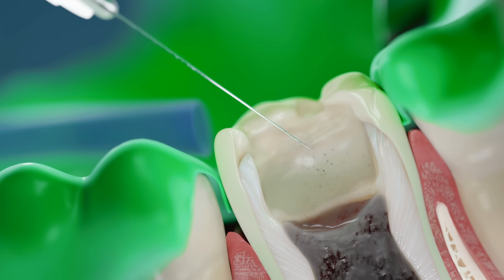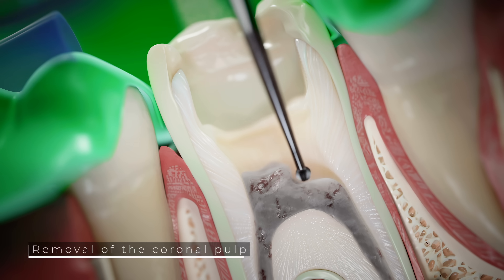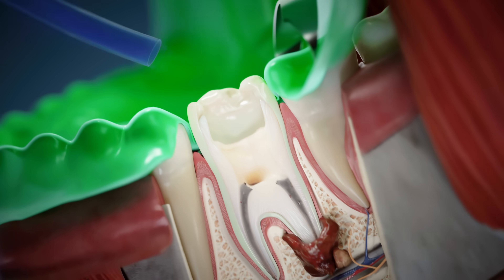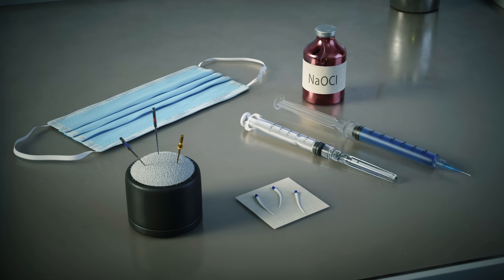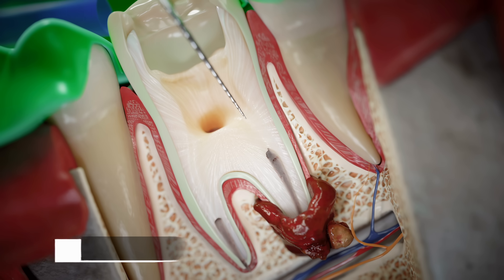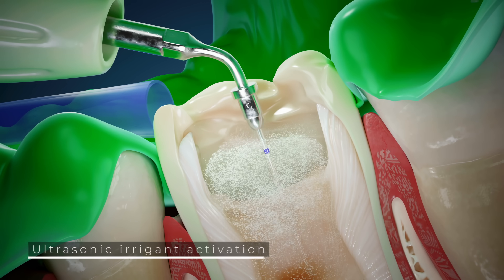The infected coronal pulp is removed, followed by disinfection. Using rotary nickel titanium endodontic instruments, the infected pulp is sequentially removed from the coronal, middle, and apical thirds of the root canals. As the procedure advances toward the root apex, the canals are continuously irrigated with sodium hypochlorite to eliminate bacteria and debris.